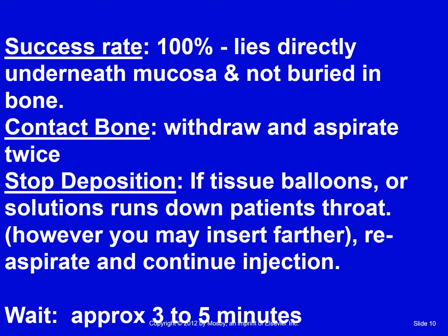If the tissue balloons or the solution runs down the patient's throat, you're going to reaspirate and continue, probably come out a little bit and go in at a bigger depth, and we'll be able to show you that better in person. We don't want the solution running down the back of the patient's throat at all. So then you wait approximately 3 to 5 minutes for the anesthesia to work.